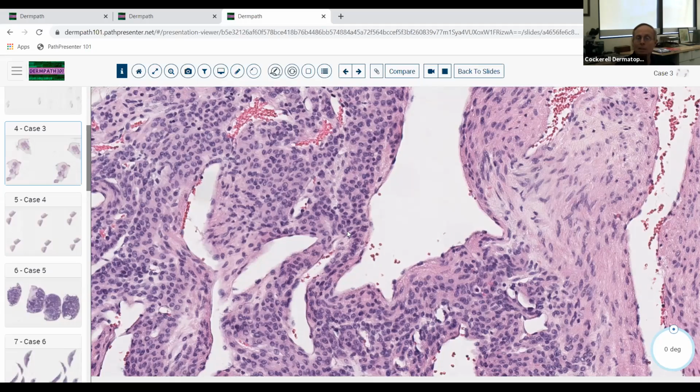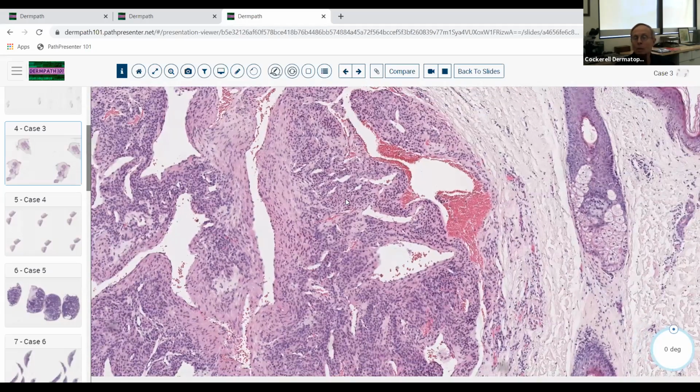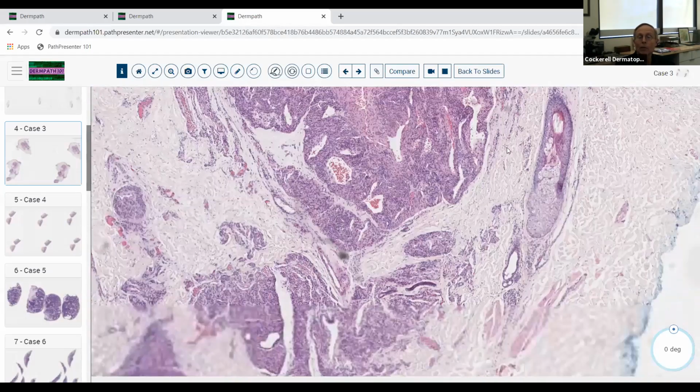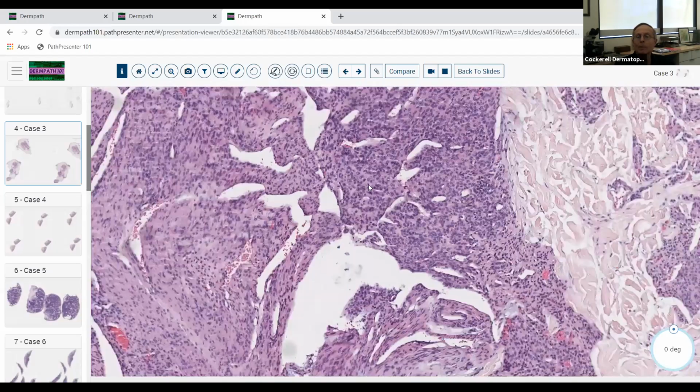When you have a glomus tumor that's got these large ectatic blood vessels, we call that a glomangioma, as opposed to a solitary glomus tumor, which is much more solid, much more cellular, a compact lesion with smaller numbers of ectatic blood vessels. A solitary glomus tumor, which is commonly seen in the nail unit as a painful lesion, would not give you these large ectatic blood vessels and these multiple nodular aggregations. If you go down to this area here, here's another aggregation. These often have two or three or four individual little neoplastic aggregations clustered together. So this is an example of a glomangioma.